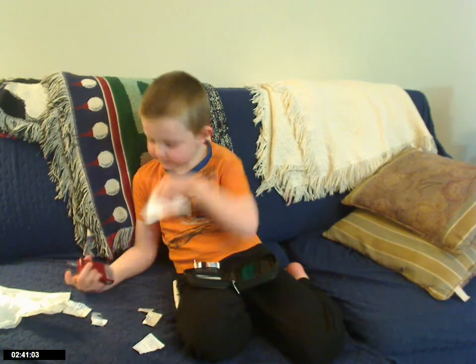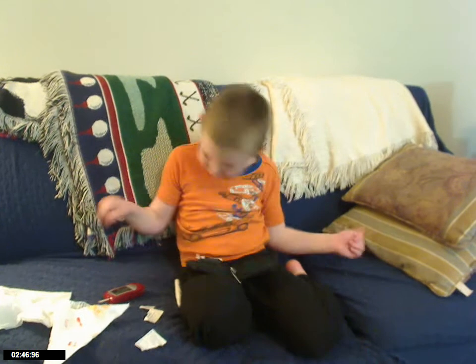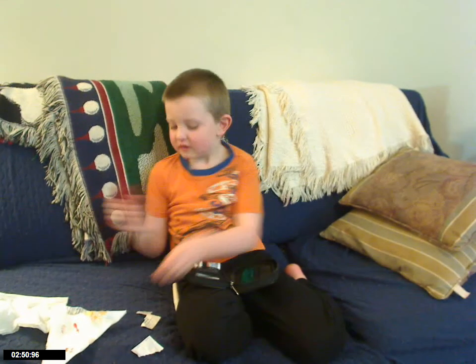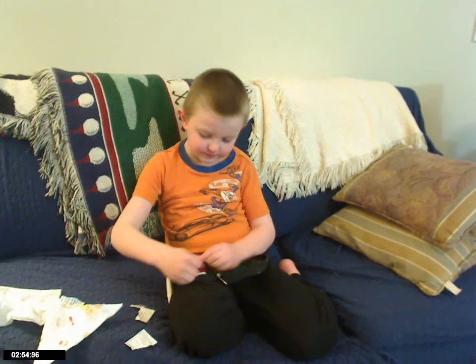Well, we're glad it doesn't hurt. So now we have to give you a shot, right? Yeah. 138 means we don't need to give you a normal shot, but since it's nighttime, we have to give you a nighttime shot. Yep. Okay, thank you for showing us how to do that.